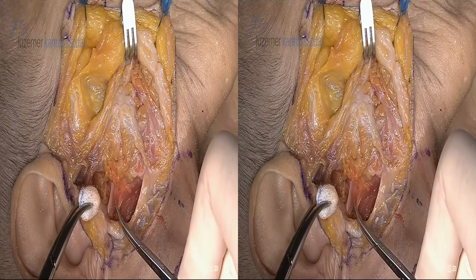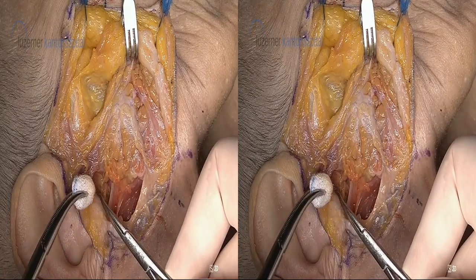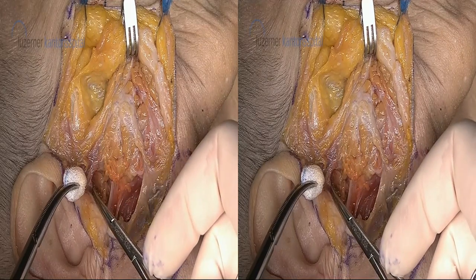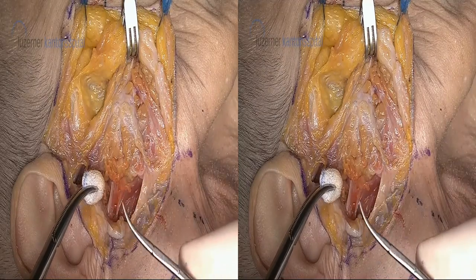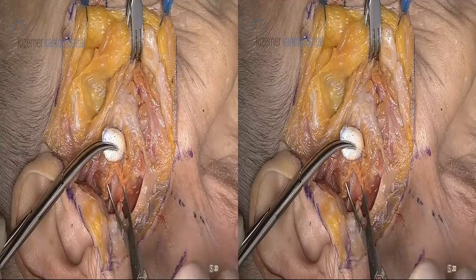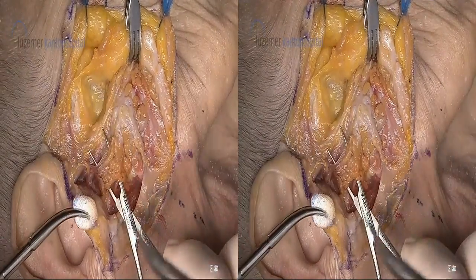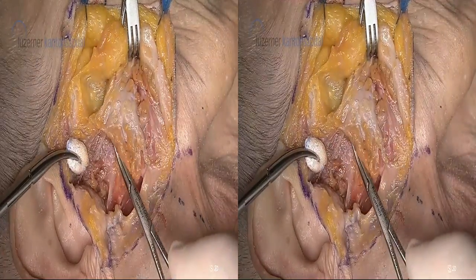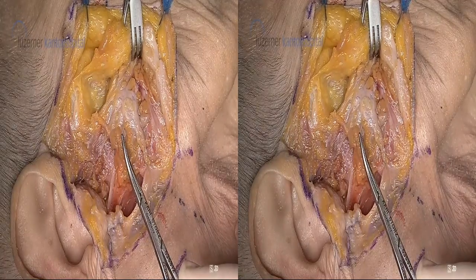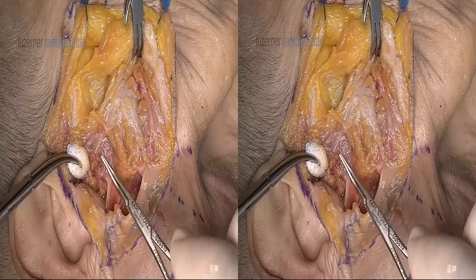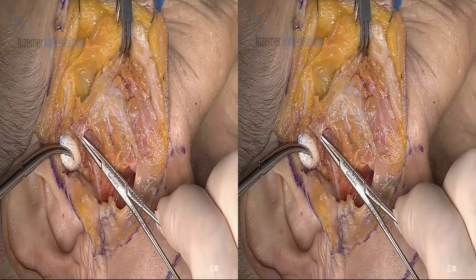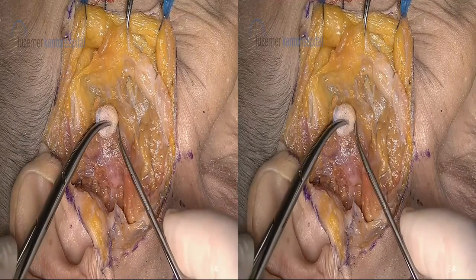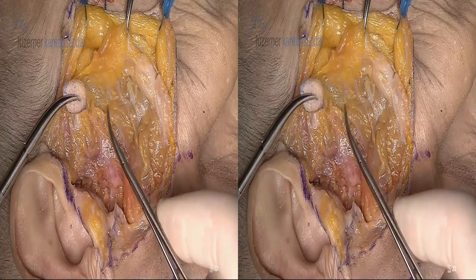Oftentimes you read about the pointer. I'm not relying on the pointer because, yes, the tragal cartilage points to the facial nerve, but I find these landmarks which Professor Fish told us for many years — anteriorly middle of the tragus, mastoid tip, line in between — is a very good anatomical guide. So we go towards the periphery: when we do a type C approach, or even a type B approach, and we need to raise this area up here, we know that the frontal branch is running in the fat pad. So if you stay lateral to the fat pad, there will not be a facial nerve. If you can follow the branches into the periphery, you can more easily dissect in between the branches to find the masseteric nerve.